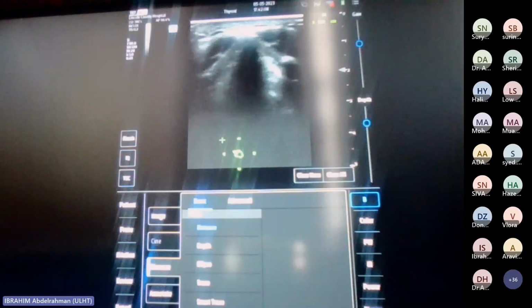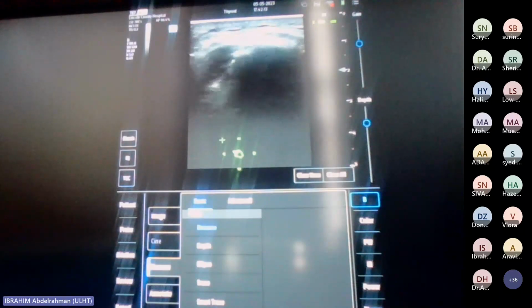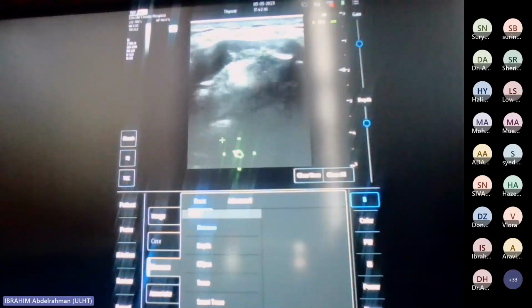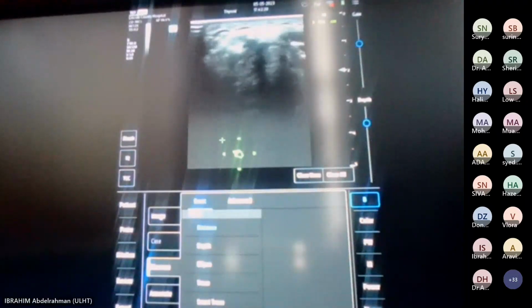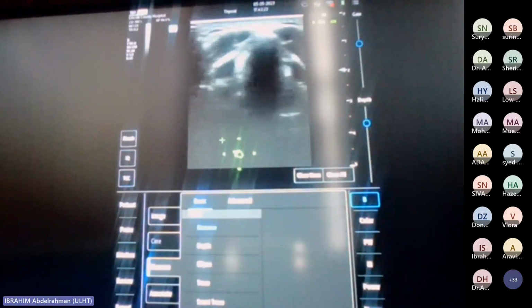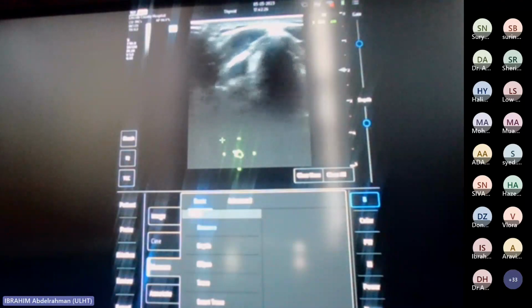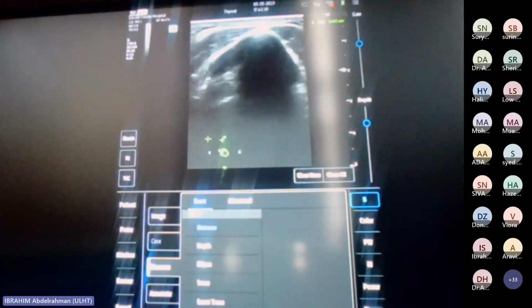So now you're down to the thyroid cartilage. A bit higher. Yeah, so there's the hyoid bone. If you saw a lesion around this area, you'd be thinking thyroglossal duct cyst. Now we're at the thyroid cartilage. Come down a little bit more and you might see the false cord section.